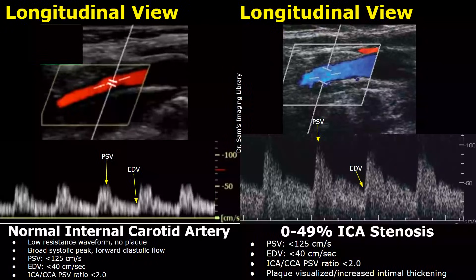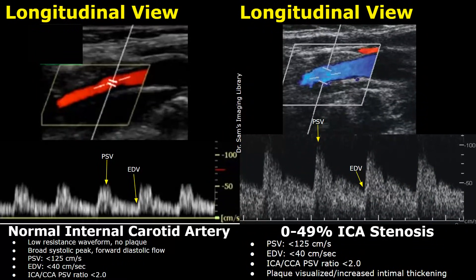Now we will look at Doppler analysis of the internal carotid artery. This is the normal color flow within the internal carotid artery, and here is the spectral waveform. It is a low resistance waveform with a broad systolic peak and forward diastolic flow. The peak systolic velocity (PSV) in normal cases is less than 125 cm per second, the end diastolic velocity (EDV) is less than 40 cm per second, and the ICA to CCA PSV ratio must be less than 2.